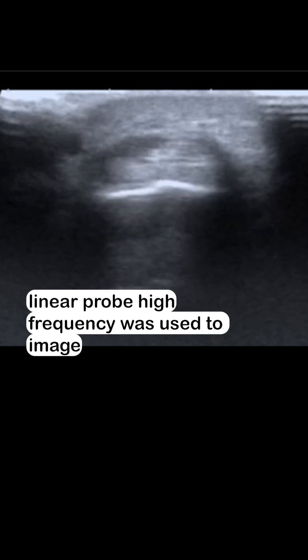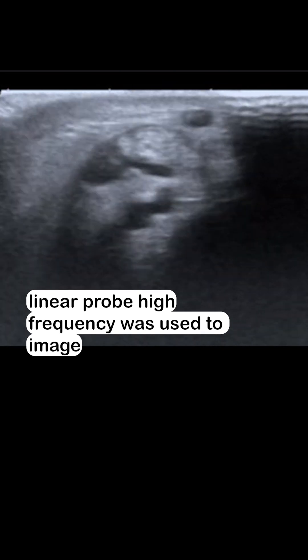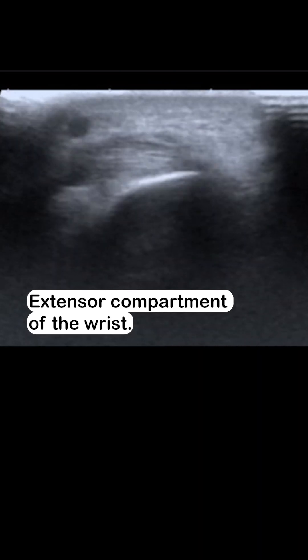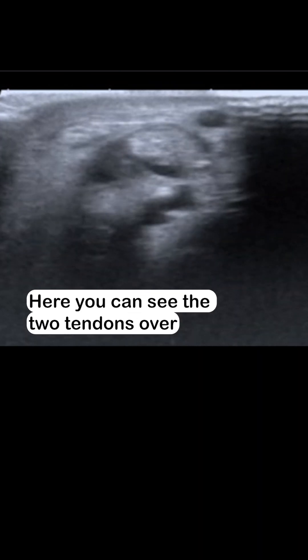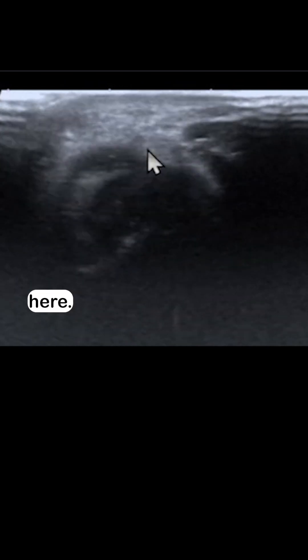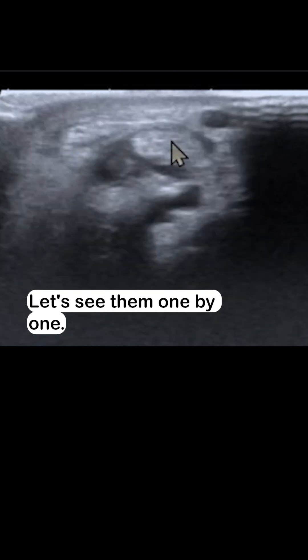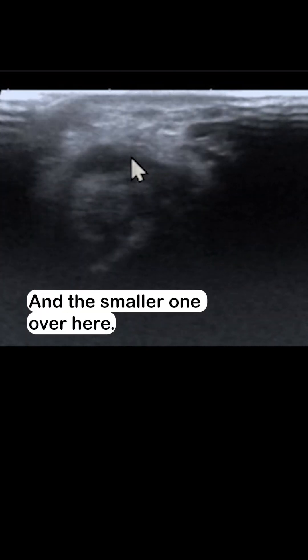A linear high-frequency probe was used to image the extensor tendons of the first extensor compartment of the wrist. Here you can see the two tendons. Let's see them one by one — the bigger one here and the smaller one here.